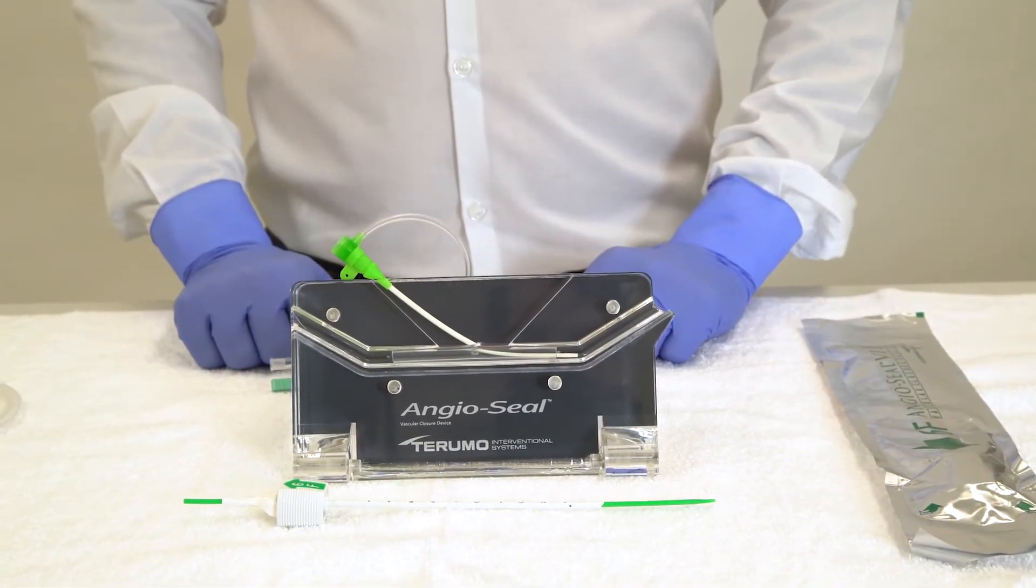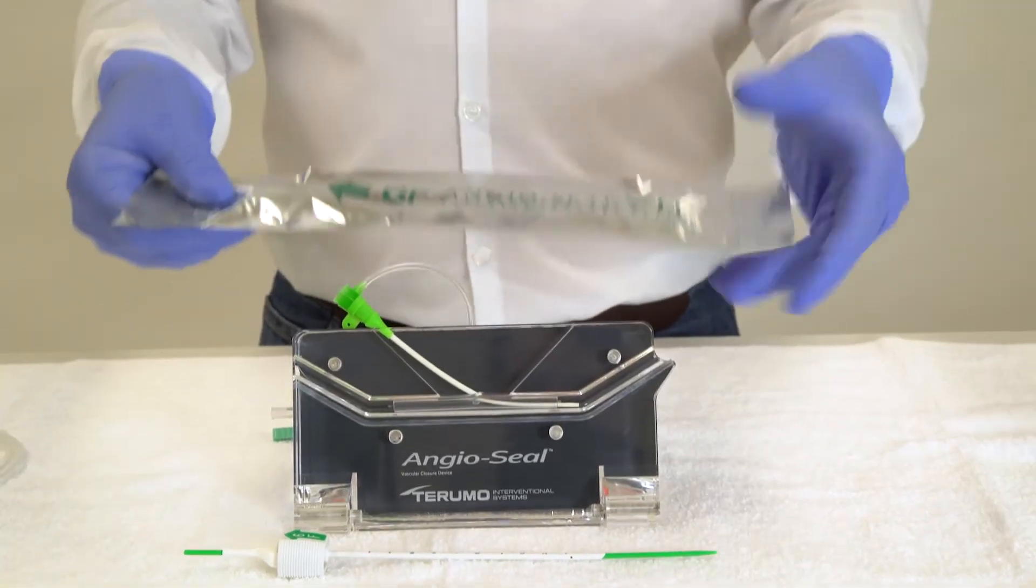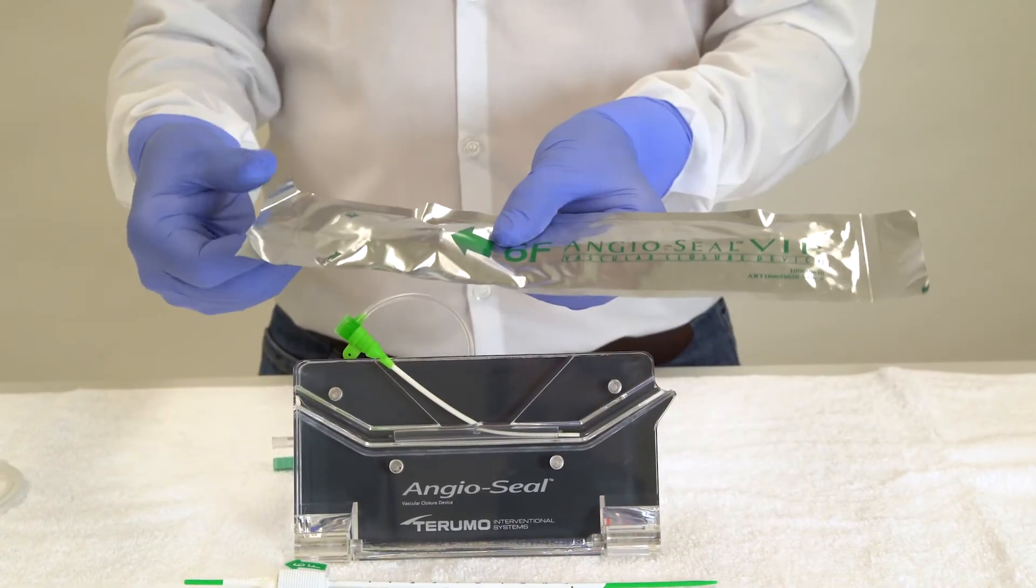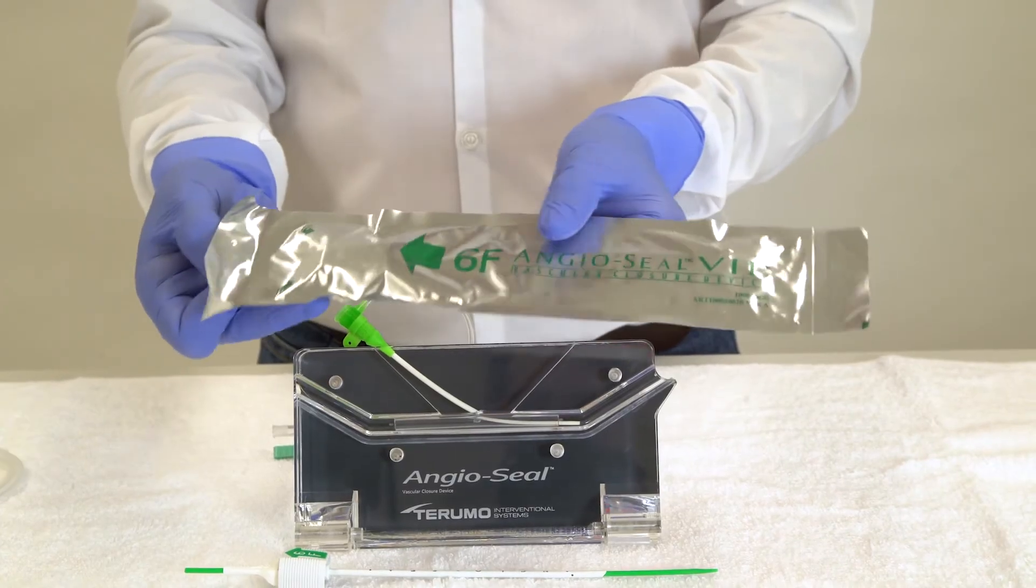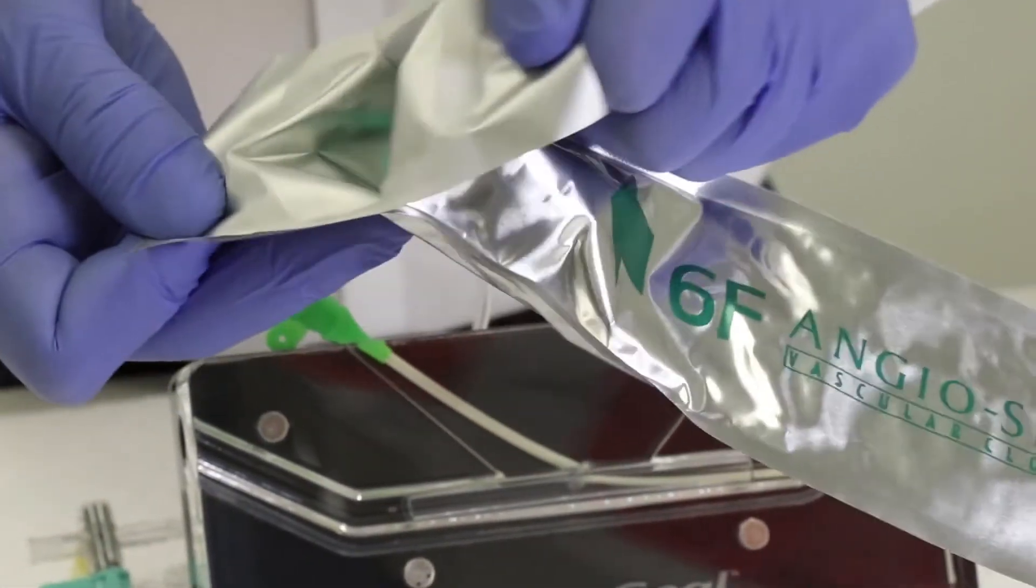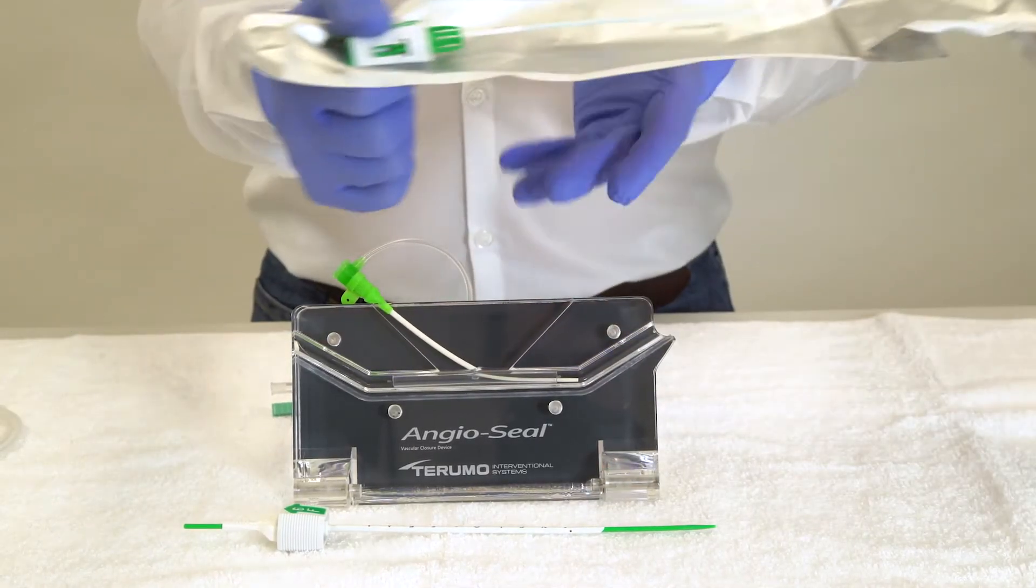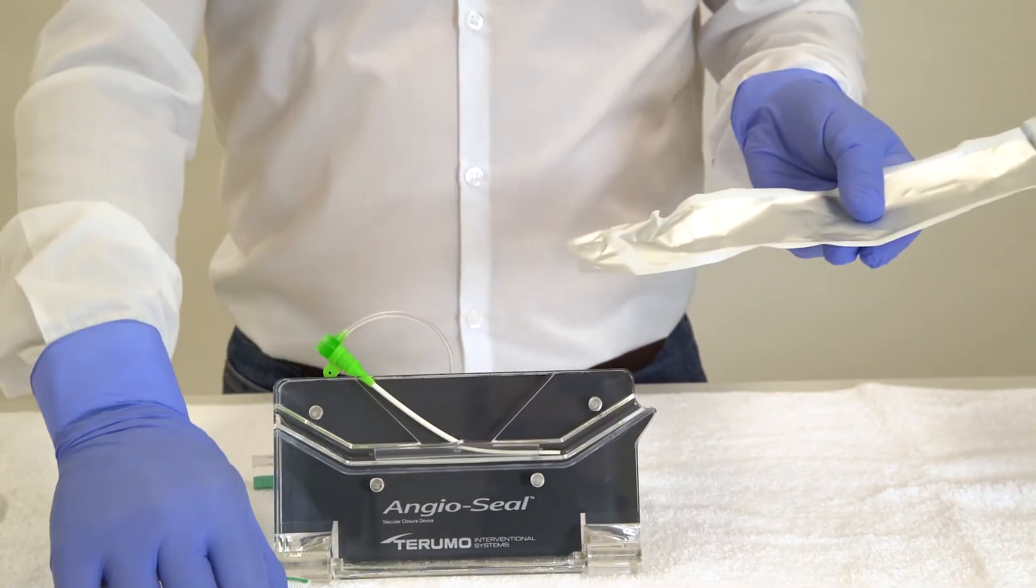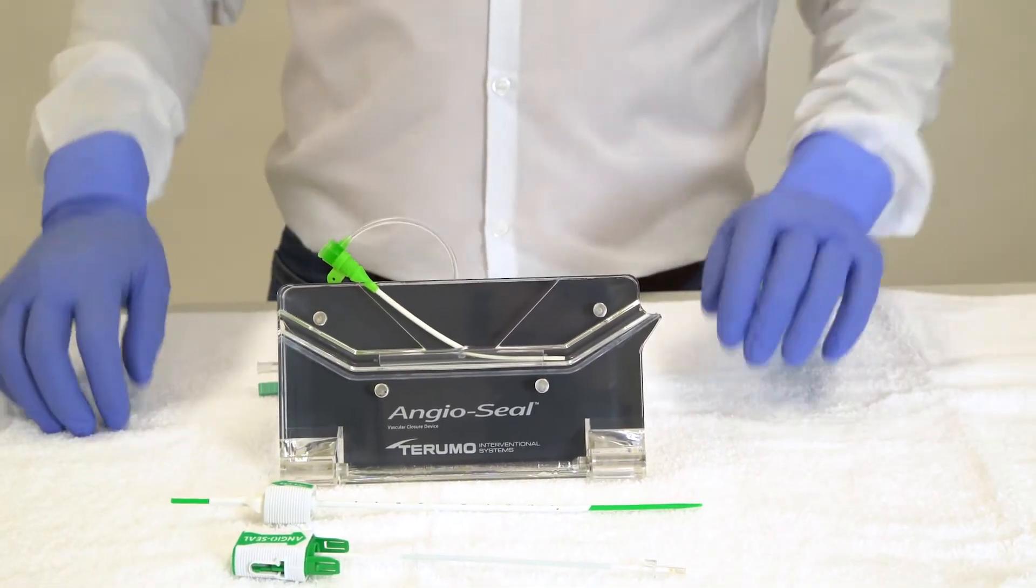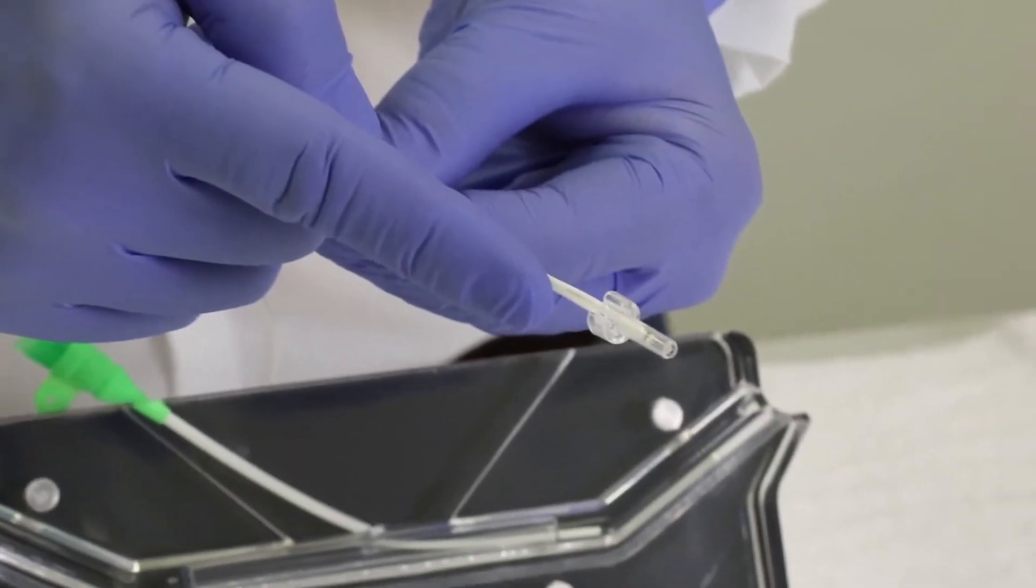The device comes in a foil patch—open it first so that it's ready. The patch has two arrows at one end indicating where to open it.